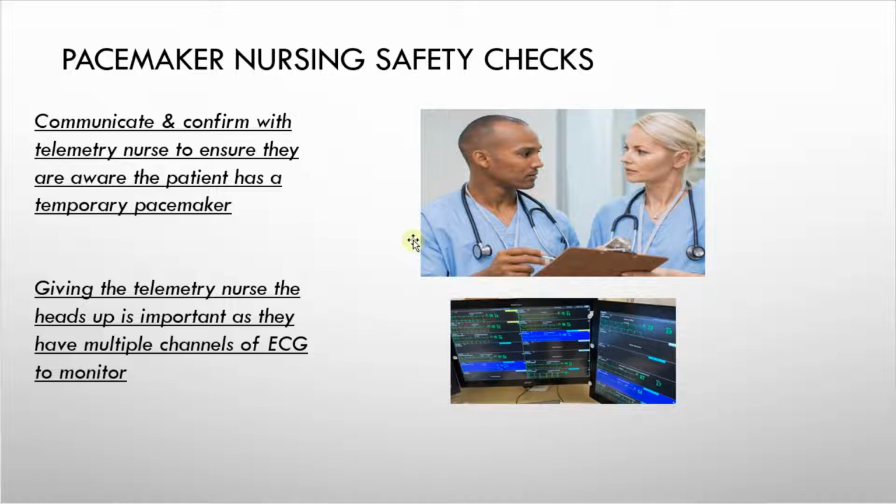So that the telemetry nurse can keep an additional set of eyes and ears for your patient, if there's any arrhythmia should they happen. In most institutions, the telemetry nurse will be monitoring more than a few different channels, so you can get an appreciation of how their attention needs to be shifted in many places. So giving them the heads up that your patient has a temporary pacemaker will definitely enhance safety for your patient.